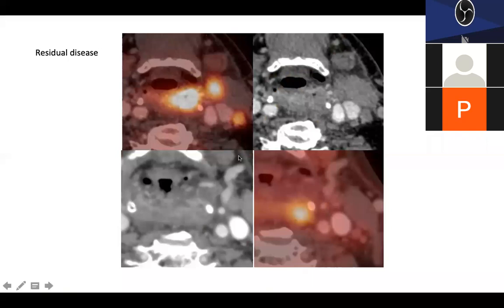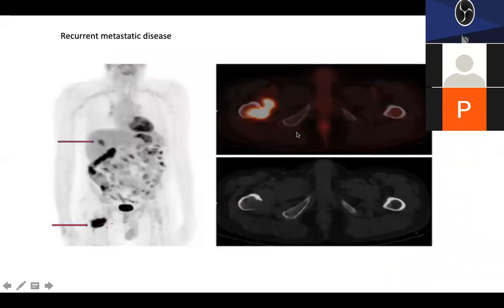In this you can see the focal uptake and all is still persisting, but most likely... you can actually still see nodes, you can see this necrotic node, but the uptake is completely gone. So this is a recurrent supraglottic cancer with liver and bone.